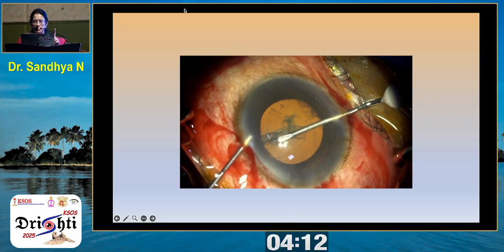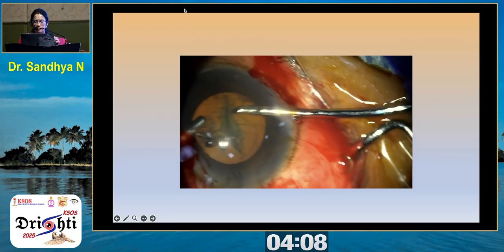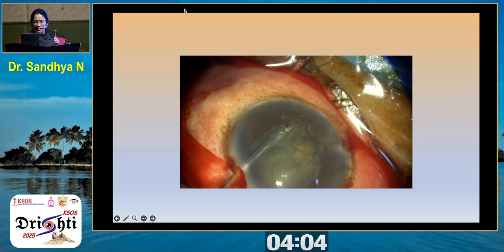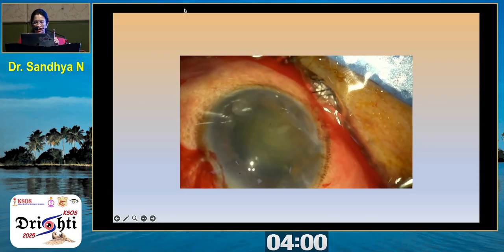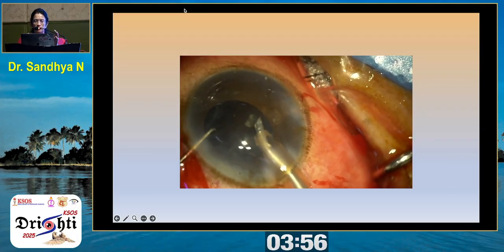Now in this patient, during rhexis, it has gone to the periphery, and I could not retrieve it. So the rhexis was completed by making a nick on the opposite side of the rhexis. Since there was compromise in the rhexis, vigorous hydrodissection was not done, and the nucleus was not very hard. So it was taken in the anterior chamber and emulsified.